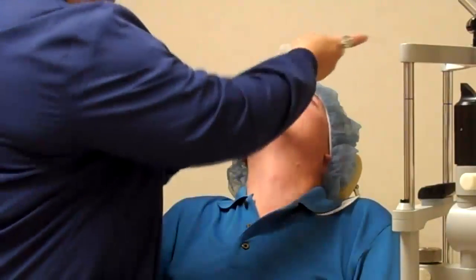The day of surgery, a patient reports to our LASIK offices. They are brought into a preoperative room. There they get instructions and are given drops before the surgery.